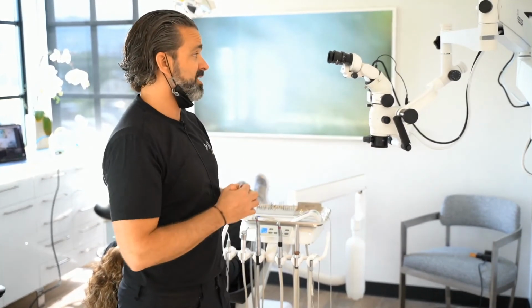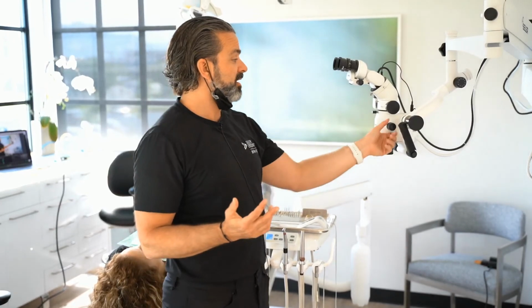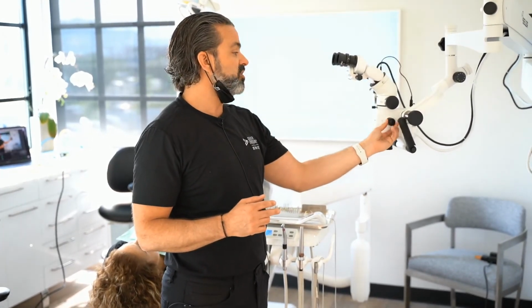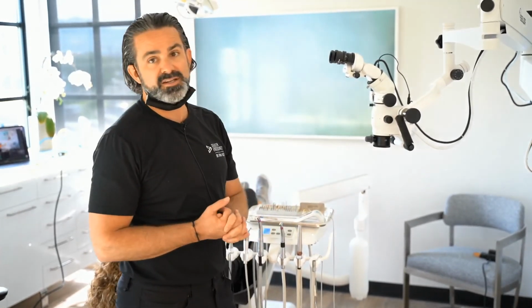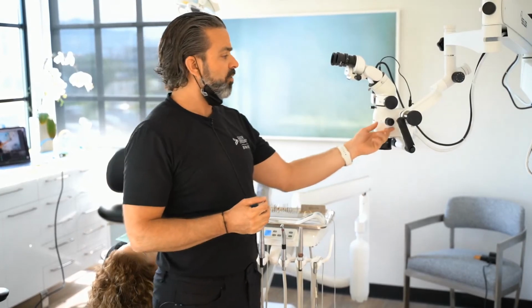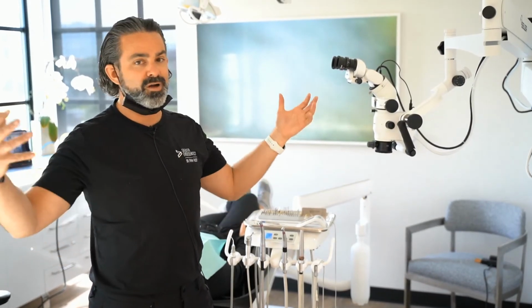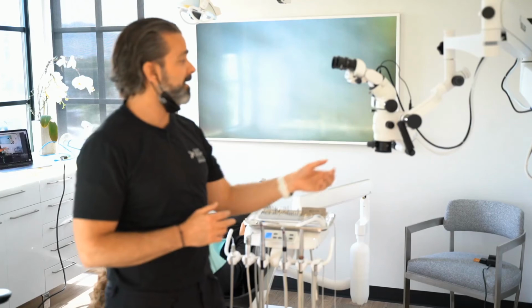Some really like the math game and will tell you the magnification factors that are going on. I don't really care about that. But I have a 1 through 6 step, which is very easy. I usually work at 3. As an endodontist, I'll access and anesthetize at a 2. A 1 step for me is a broad field of view. It's really more for something that you're seeing today. I don't ever really use the 1.